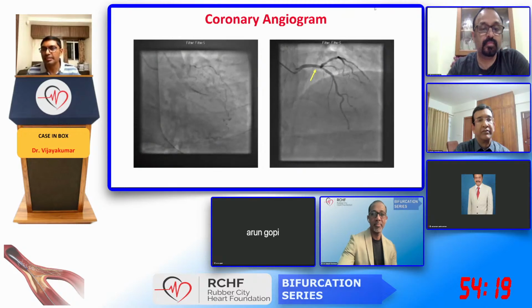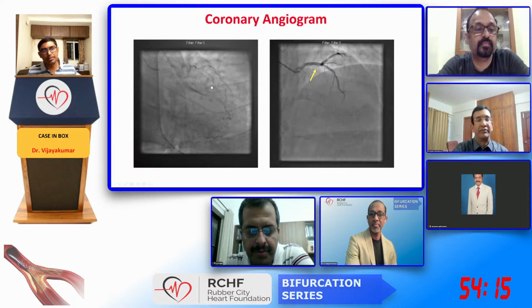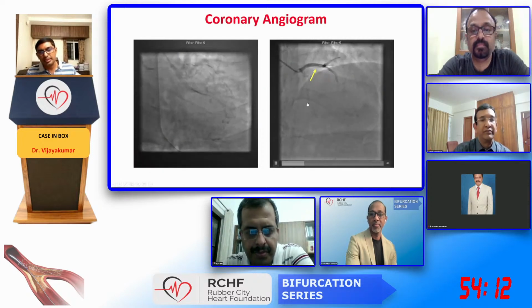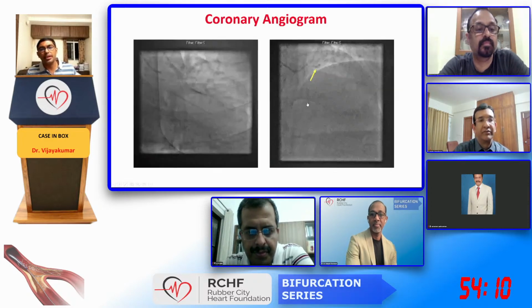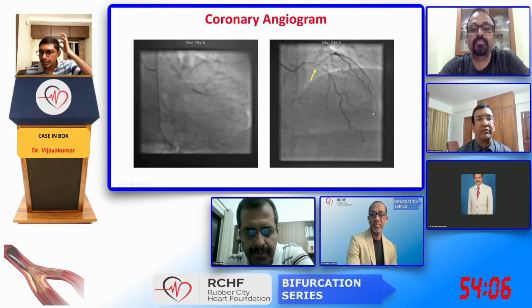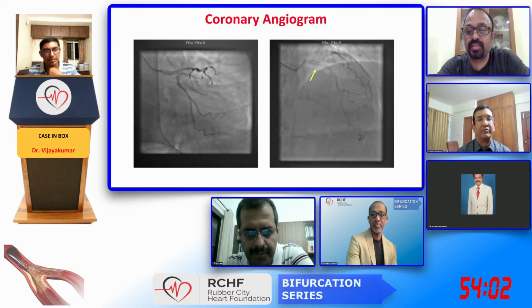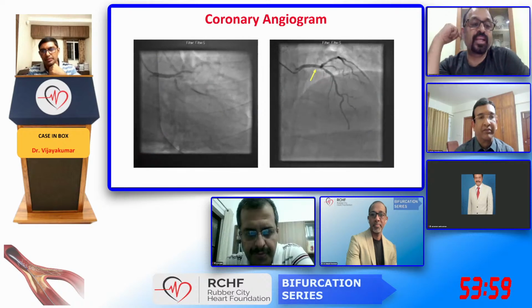You are muted, sir. Any other views, Vijay? These are the two views which showed the bifurcation better, and the next one is RCA. I'll show additional views when we go for it. This is a diagnostic angiogram of this patient. So this is the left main bifurcation, isn't it? Yeah. Okay, so I'll make a small beginning.